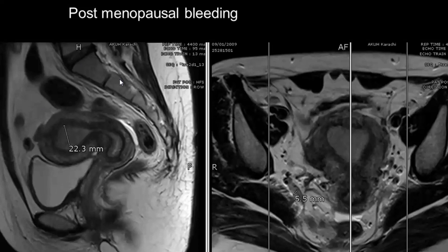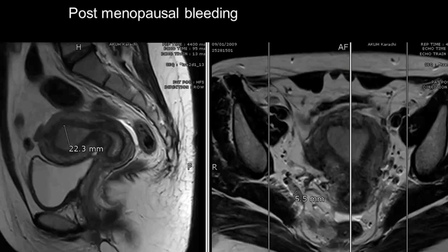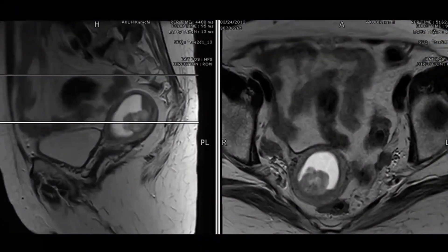Another case — post-menopausal bleeding. Endometrial carcinoma is hypointense to endometrium. You will find increased endometrial thickness, and you have to assess whether there is more than or less than 50% myometrial invasion. You measure the normal myometrium and see if the remaining myometrium is less than or more than 50%. Endometrial carcinomas may also appear like polyps, arising from the posterior myometrium, with blood and fluid within the endometrium.